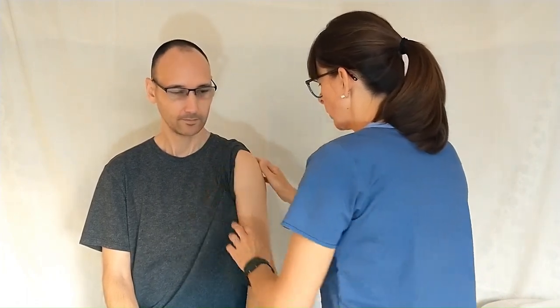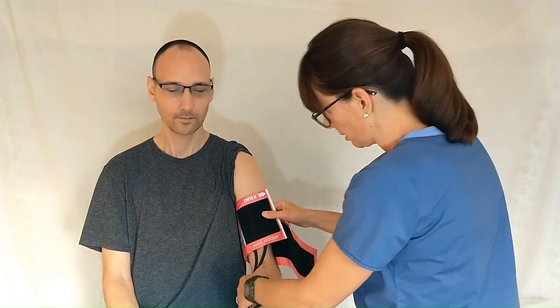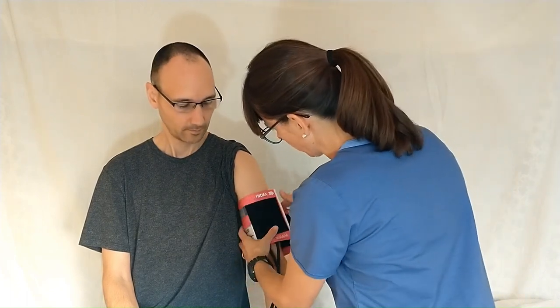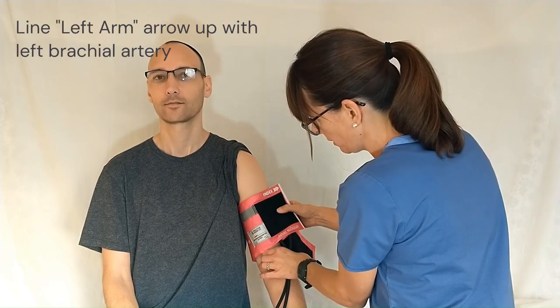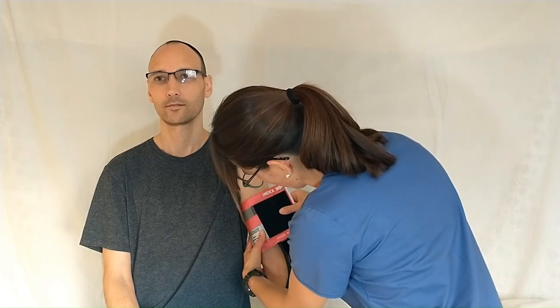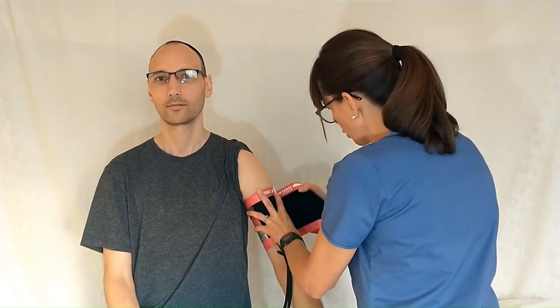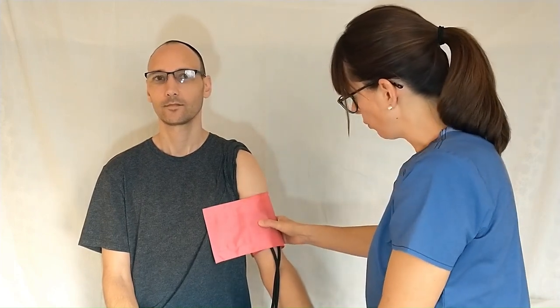We want to make sure that we don't put the cuff over a piece of clothing because that might alter the result. I'll take my cuff and place it around the patient's upper arm — in this case the left upper arm. I need to make sure I line the arrow up with the brachial artery, so I will feel for the brachial artery, right there, and line my arrow up. Then I will close the cuff with the velcro and make sure that it doesn't move.